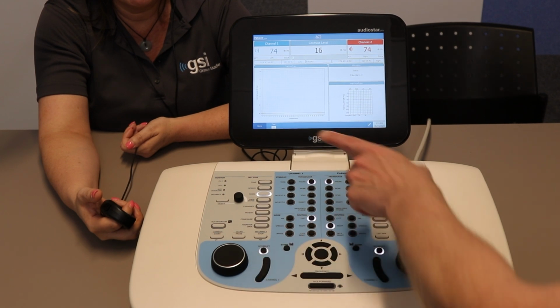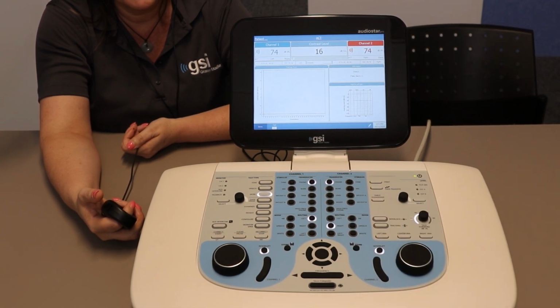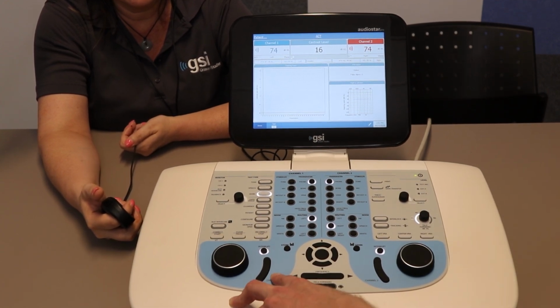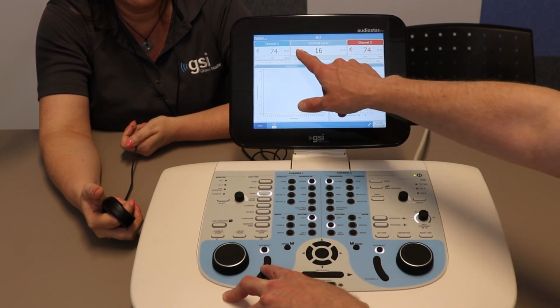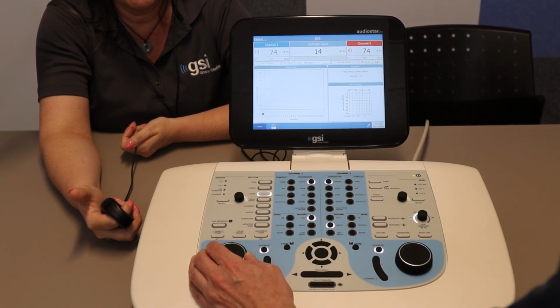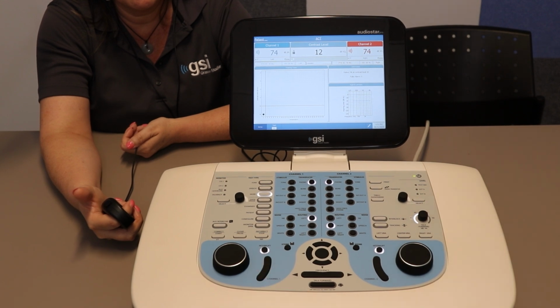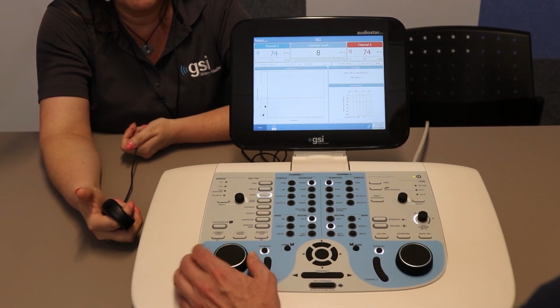So my crosshairs are in the lower left-hand corner here. Now that the noise is playing, my job is to put the stimulus into the noise and then look for responses. I interject the stimulus with the channel 1 bar here. So I'm going to press that presentation. You'll see a little lock sign by the 16. Knowing that tells me that the stimulus was put into the noise. Laura responded, so I'm going to move 2 steps to a contrast level of 12. We're reducing that contrast level and trying again. Perfect. And then I'm going to go down again to 8.